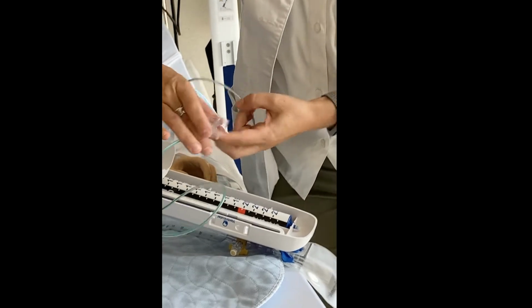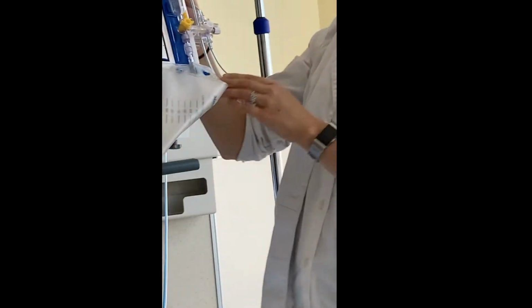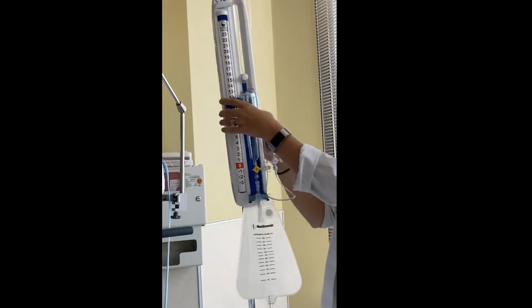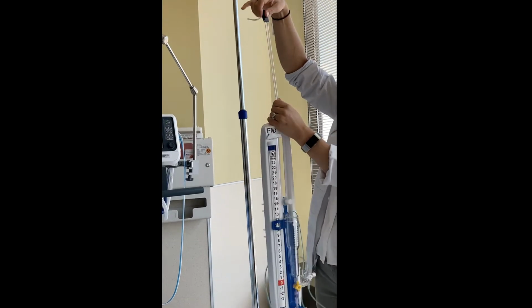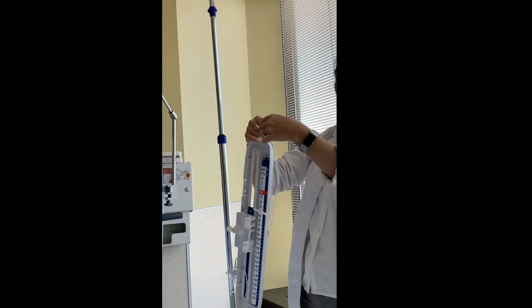As I'm doing this, a reminder that when you're operating the system, you have to remain sterile. I'm not currently using gloves because this is a demo system, but you would normally use gloves. Okay, so how do you put this up? You will notice that there is a string here and the little black clip moves up and down to allow you to adjust for height.